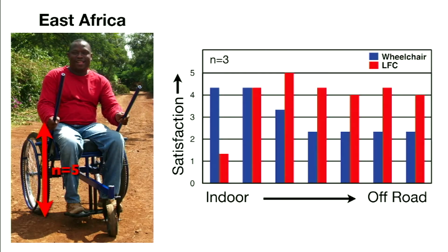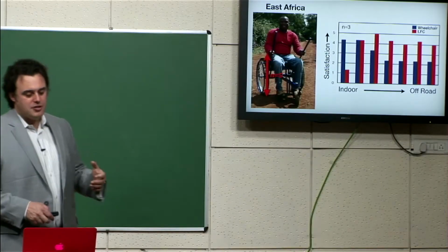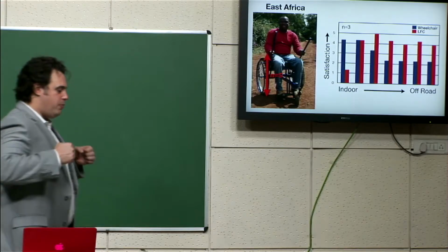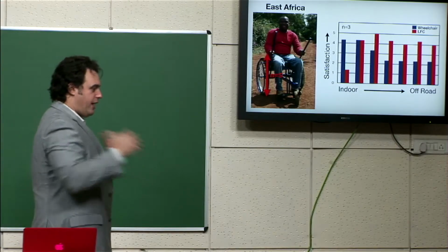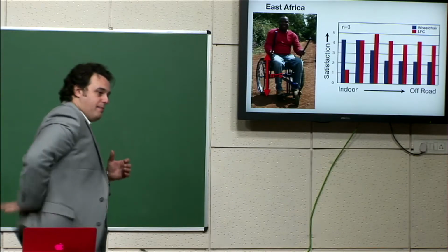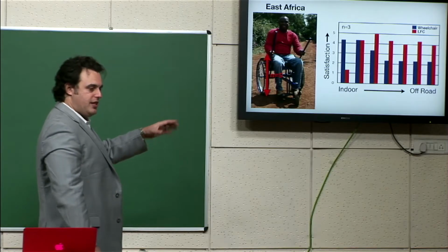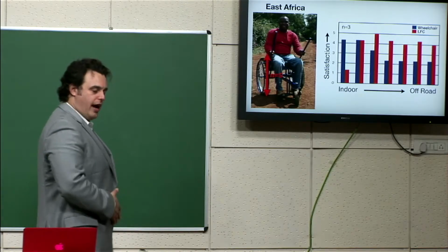Next thing we realized is that the chair was rather tall, and people felt uncomfortable, like they could maybe tip over backwards if they tried to climb up a hill. And what exacerbated this is that when you push on the levers, you get a reaction force that's pushing you back, and that has to be supported by the back of the chair. Now, if we have a person with a spinal cord injury using this, they may have lost control of their abdomen muscles.